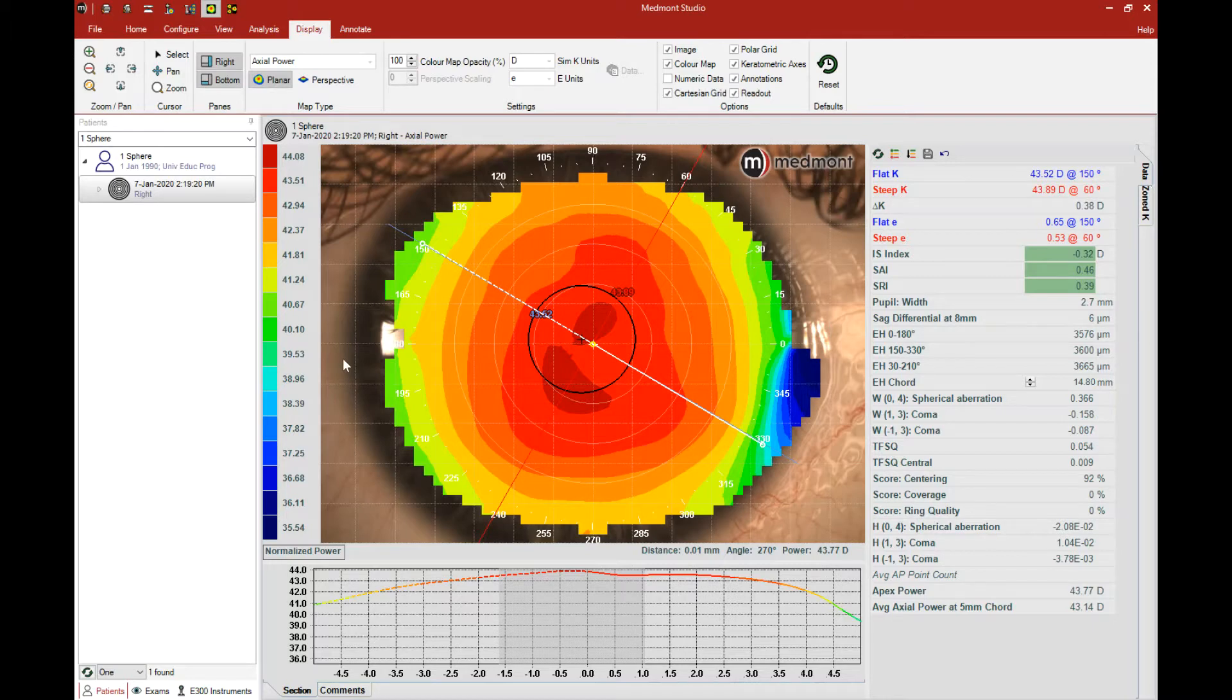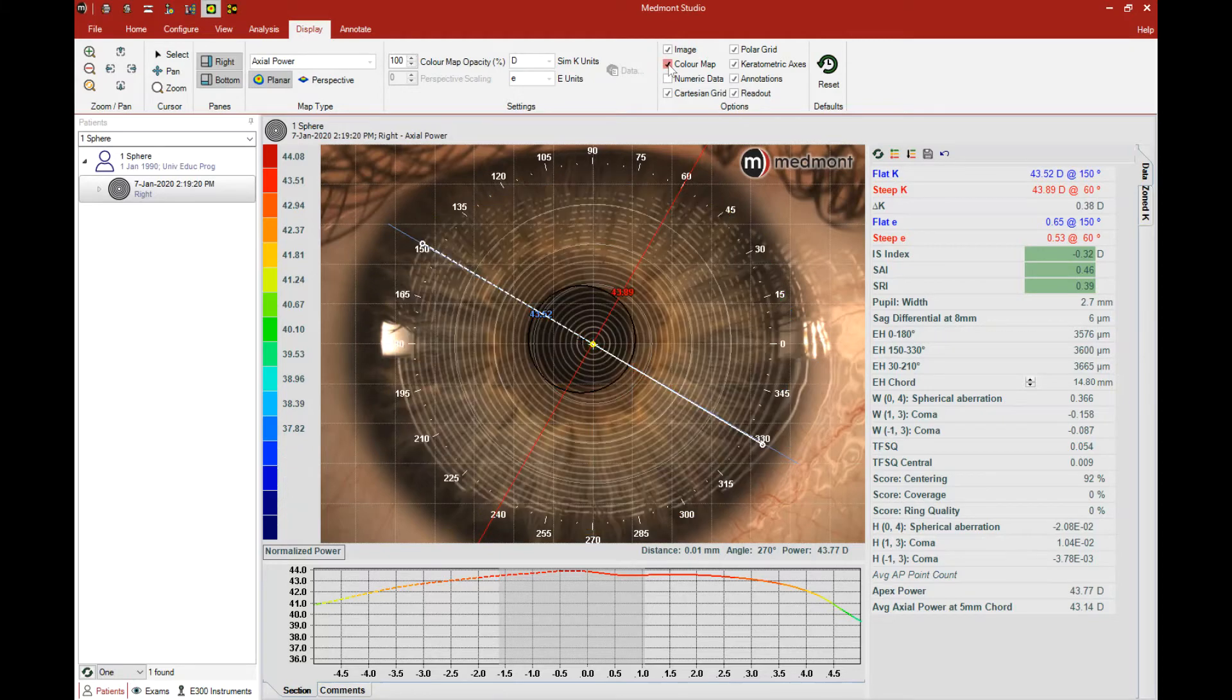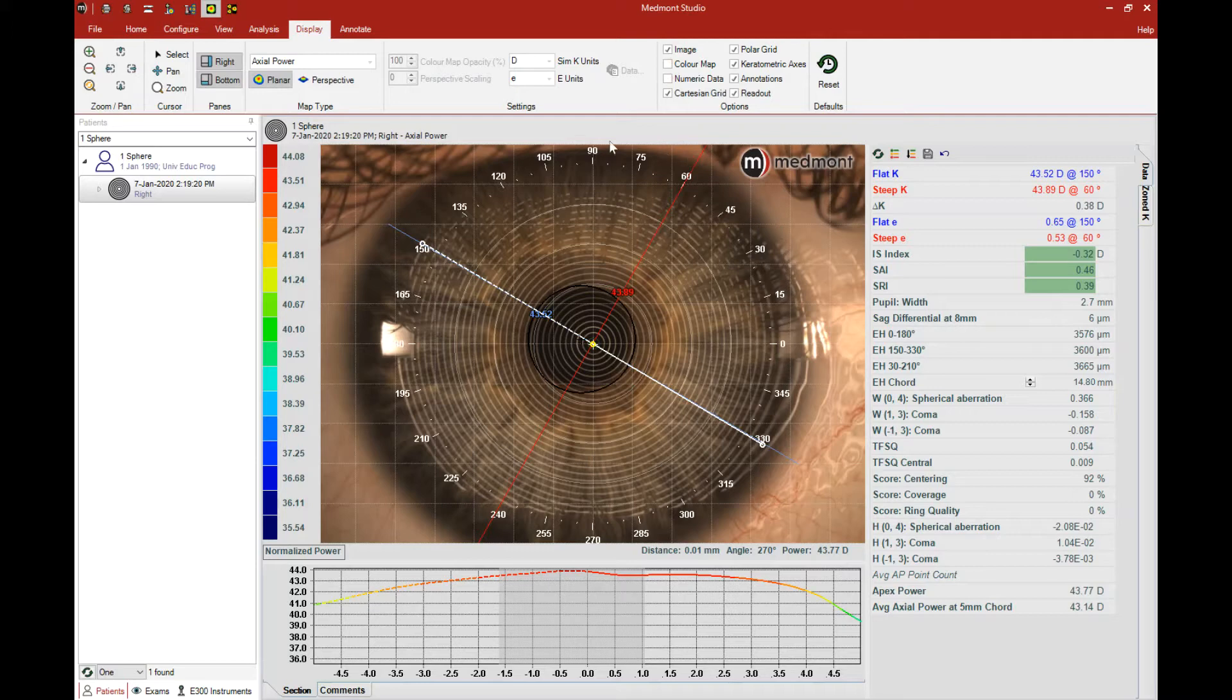If that border is partially obscured by the diameter of the topography, go to Display and uncheck Color Map. That way you can see the entire visible iris diameter.